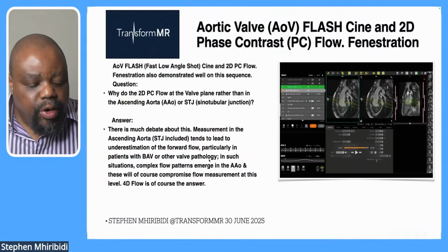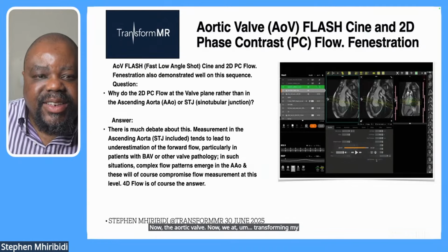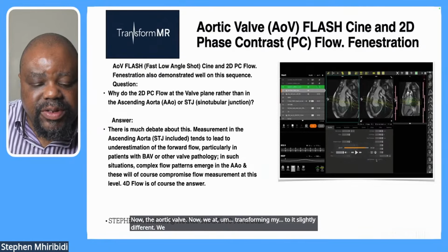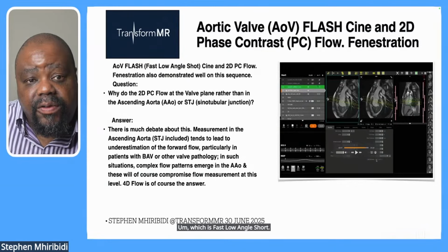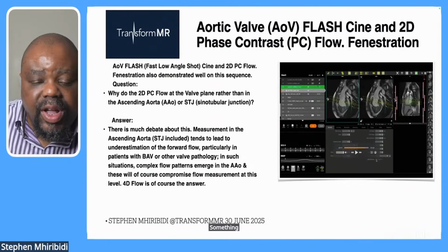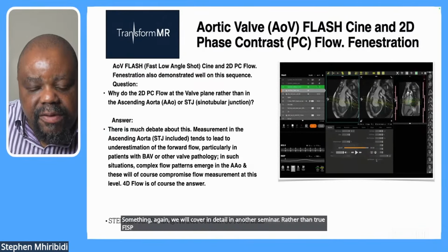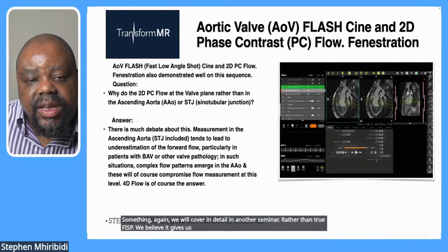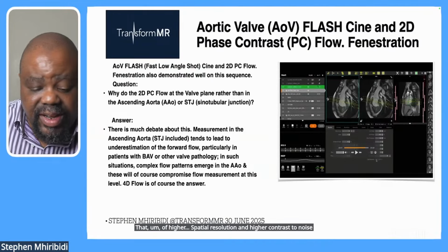Now, the aortic valve. Now, we at Transform MR do it slightly different. We prefer to use FLASH, which is fast low angle shot, for our valve view cines, something again we will cover in detail in another seminar, rather than true FISP. We believe it gives us images of higher spatial resolution and higher contrast to noise, believe it or not, than our true FISP ones.